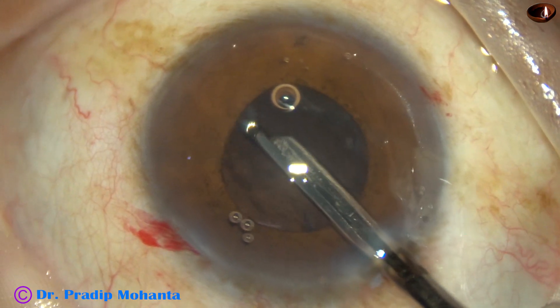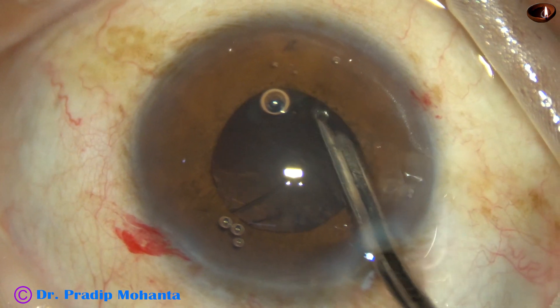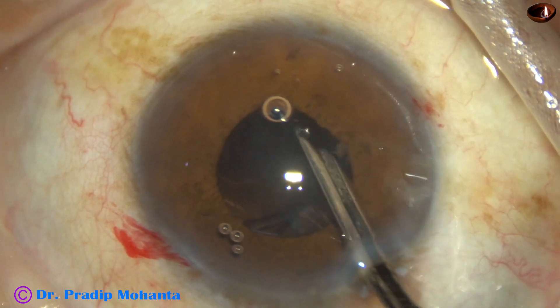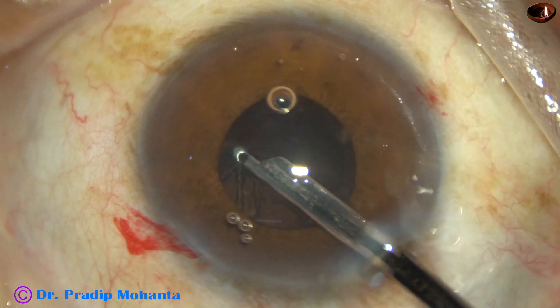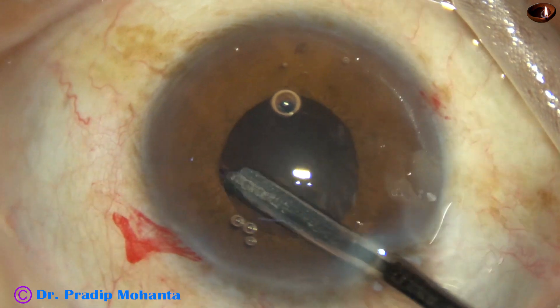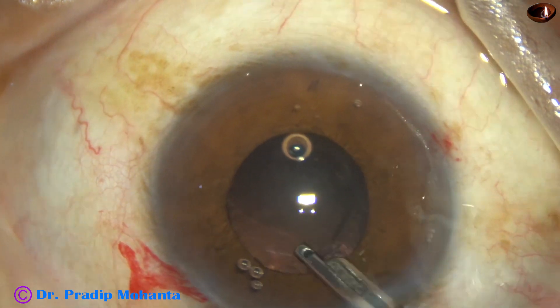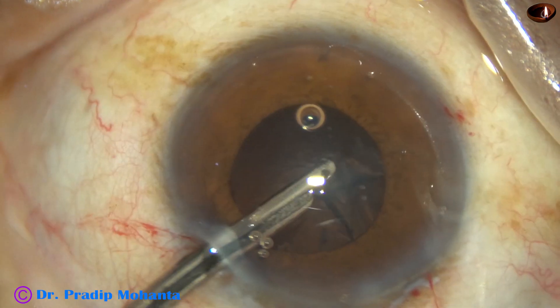Now I'm using a 23-gauge Simcoe cannula for removal of cortex. I touched the iris at seven o'clock and the pupil is becoming small. In IFIS, whenever we touch the iris, the pupil tends to become more small.